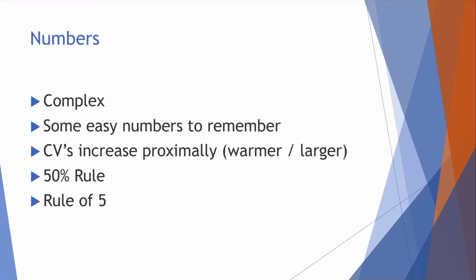Numbers in neurophysiology are inherently complex, and they are quite frightening to those who are not neurophysiologists and aren't working with this data day in and day out. There are lots of reasons for variability in the data. Some of these can include factors such as height, so taller people tend to have smaller sensory nerve action potentials, and girth, for example, is also quite an important factor. Someone with a larger girth tends to have smaller responses, and the reason for that's pretty simple, in fact, because there's more padding between the surface electrodes and the nerve underneath. So there are lots of potential factors that one has to bear in mind, and if a patient has, for example, edema, that can also be a factor to take into consideration too.